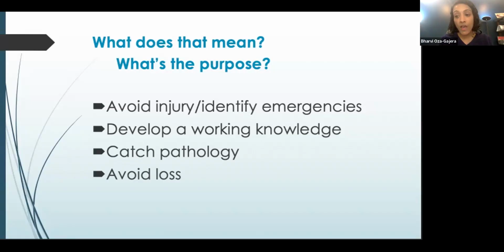We also want to identify any access emergencies before cannulation. So if there is some sort of emergency or something that just does not look right, we want to get that patient to someone else who can fix it, either via the emergency room in the hospital or to an outpatient surgical center, so that those emergencies can be identified and corrected before that patient is cannulated. So those would be things like identifying infection, impending rupture, any sort of aneurysm that seems unstable. All of those things would need to be referred, and you should not cannulate those patients.